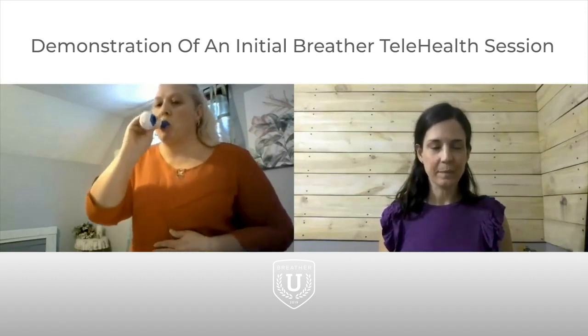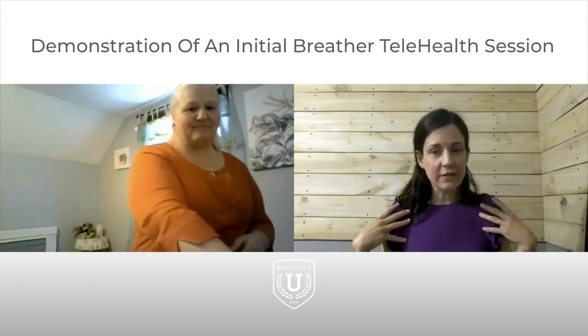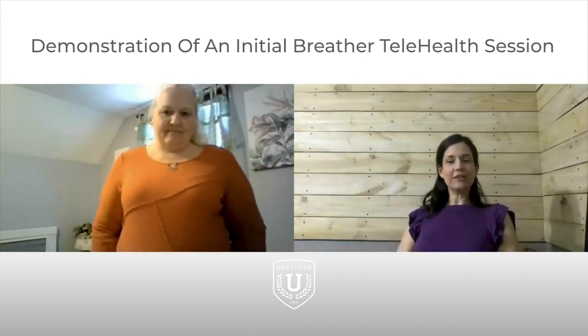Good. Wow. Beautiful. If you find yourself doing the shoulder thing more, sometimes it's helpful to do the breather leaning back. It encourages you to relax your shoulders, and if you put the resting hand over your diaphragm, so if you have a recliner, you can lean back, and it makes us less prone to do this. Your diaphragm's by far the largest muscle for respiration, so let's go ahead and let it do its work.